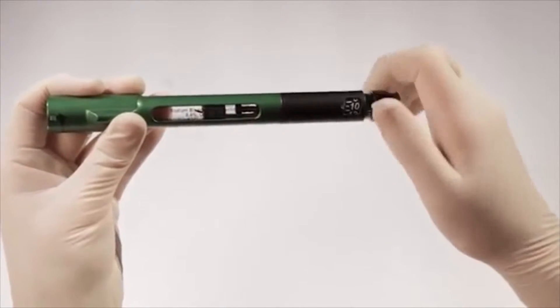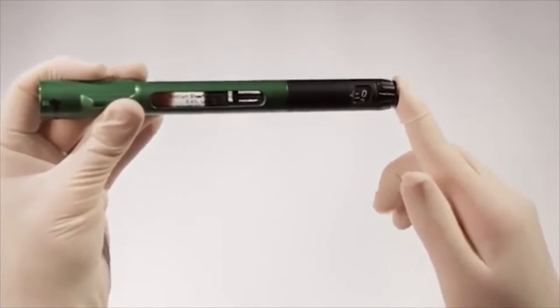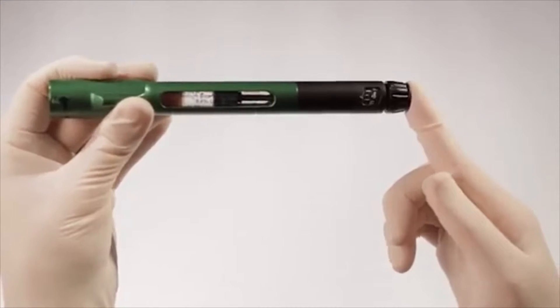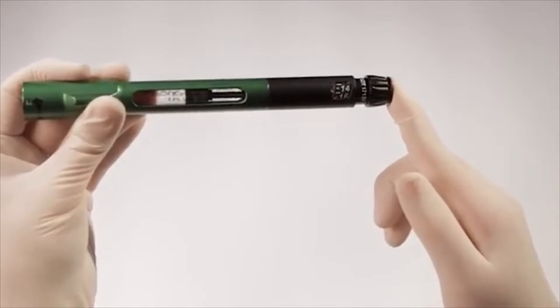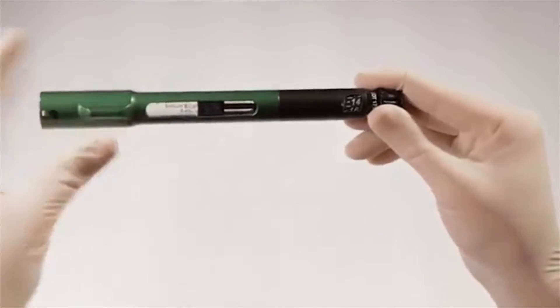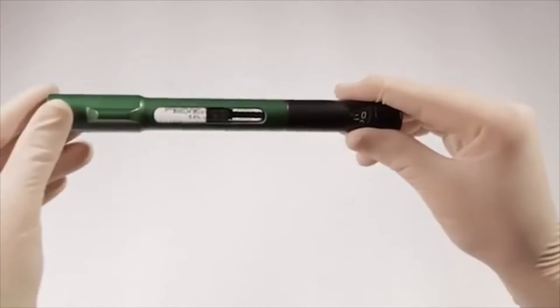To do this, turn the volume dial to any number and gently push the dispensing button until you feel the piston rod make contact with the rubber plunger. You may need to repeat this step. You'll know that the piston rod is against the rubber plunger when the dispensing button stops before reaching zero. Then turn the volume dial back to zero before using the pen to mix the solutions.